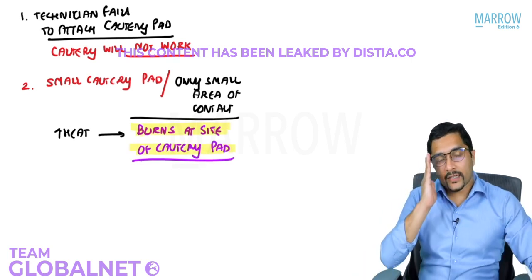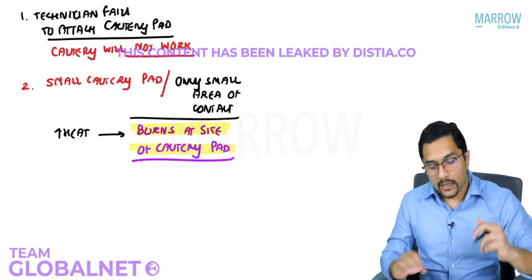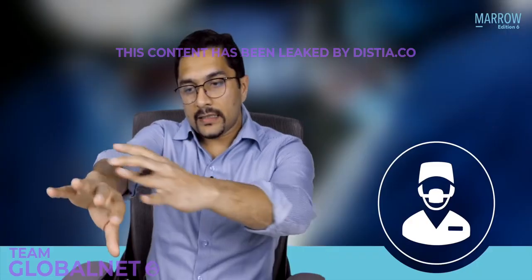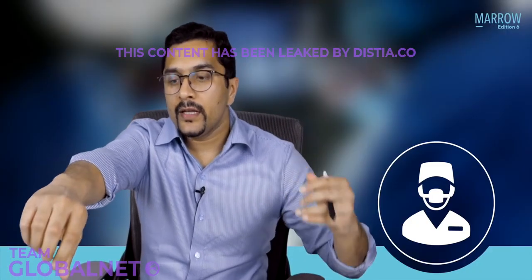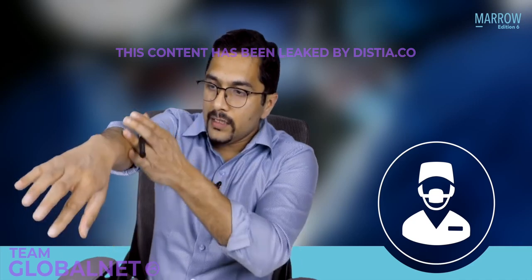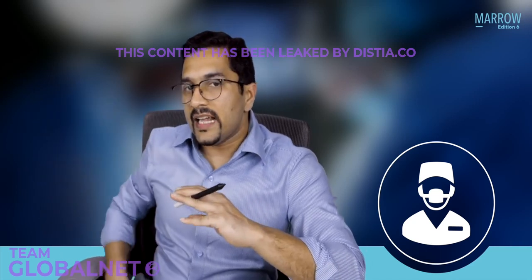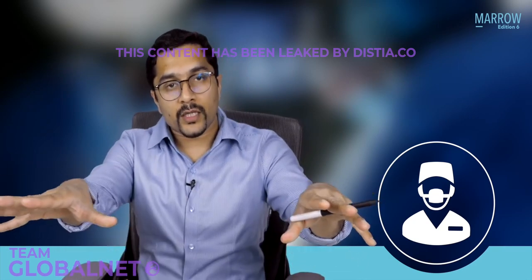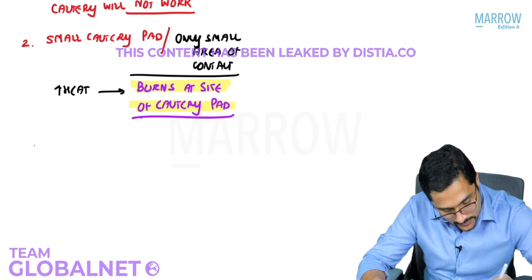So these were the points regarding cautery pads. Now, in a monopolar cautery, I have just told you that the current is traveling through the body, right? So supposing I am cutting in the arm, the current will travel through the body and will exit out through the thigh where the cautery pad is. So the current is moving through the body, right?